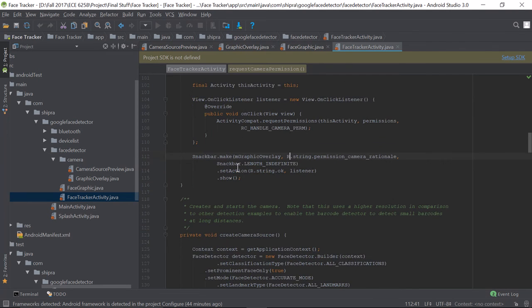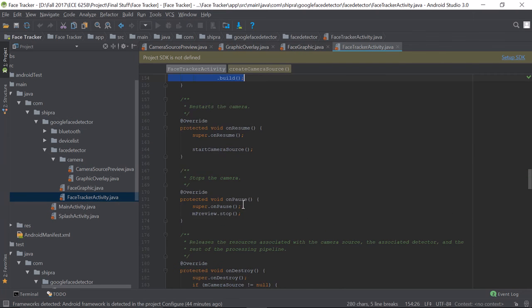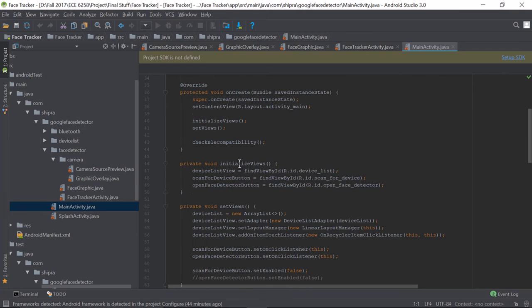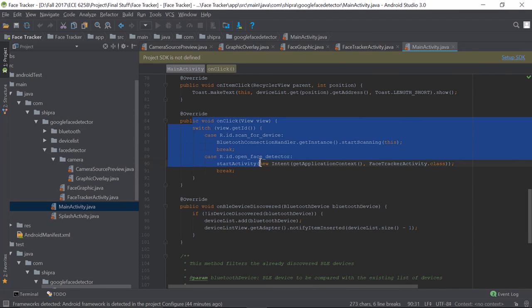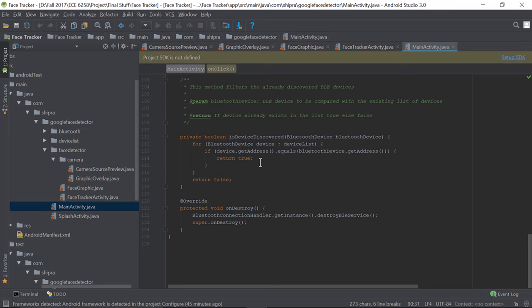Up here in the face tracker Java, this is where all the functions and how they are being implemented is used, the camera and everything. So once you are done with this, we can come down to the main activity. This is where finally all the code is being compiled, how the Bluetooth functionality works, what happens when you click certain objects. As I said, we have currently disabled the Bluetooth part because in general, unless you connect the Bluetooth, you won't be able to do the face tracking. So just to make sure that the app runs on any mobile device for the moment, for the face tracking, we have disabled the Bluetooth part.